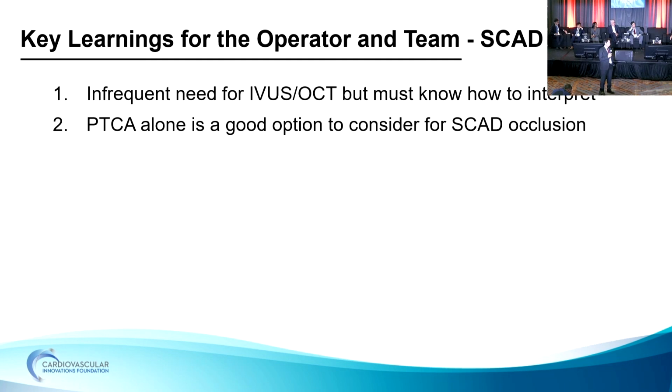You may be in the true lumen, but if you're not in the true lumen, what can you do? Well, you push it down and you fenestrate, because in all cases you can actually restore flow. I tell you, this is relatively easy.